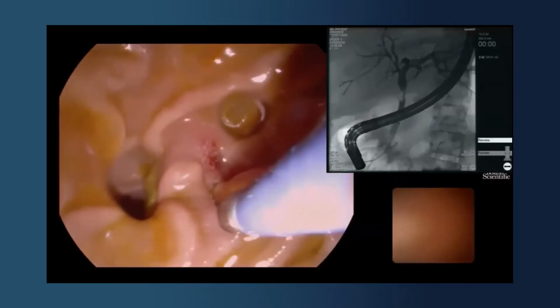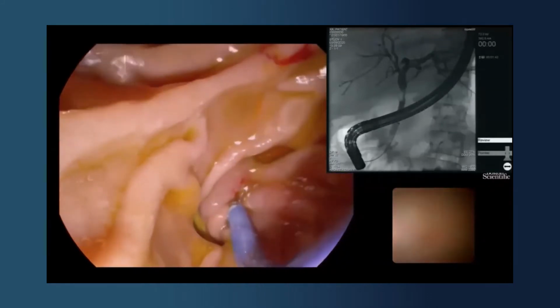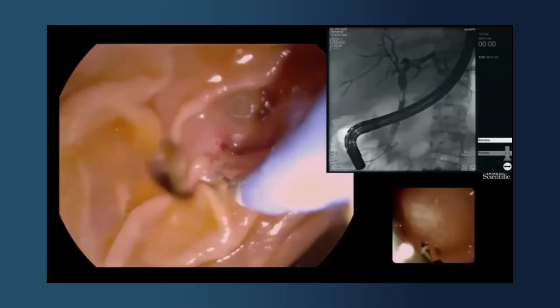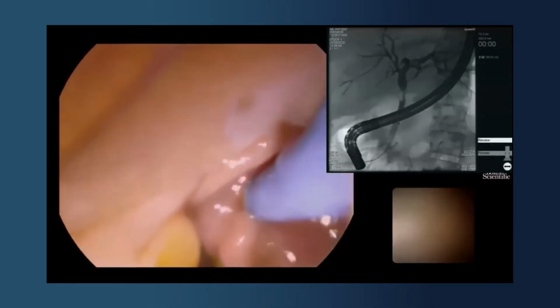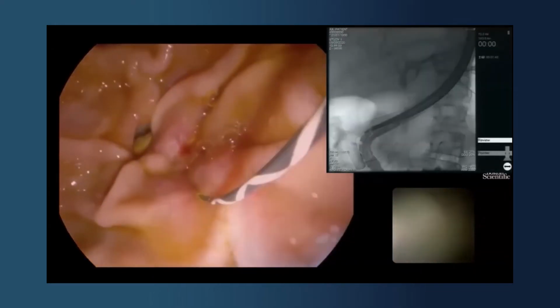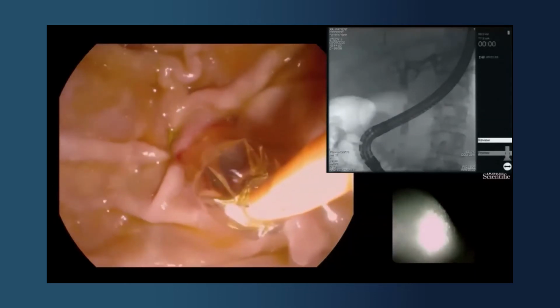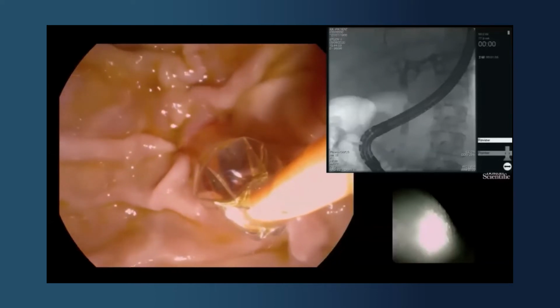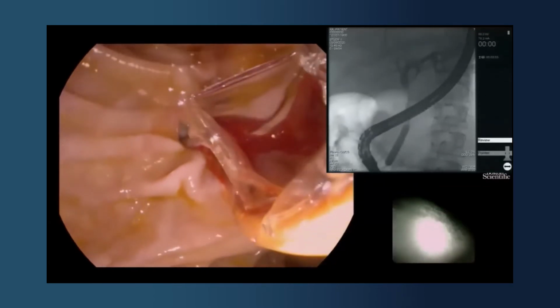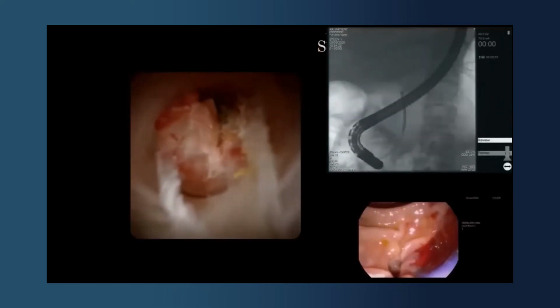This patient was referred with a history of obstructive jaundice with a common hepatic duct stricture on imaging and stones in the gallbladder. An initial challenge with Spyglass was, despite a sphincterotomy, inserting the SpyScope, and so, as we quite often do, I performed an 8mm balloon sphincteroplasty following sphincterotomy. That then allowed much more straightforward insertion of the SpyScope.